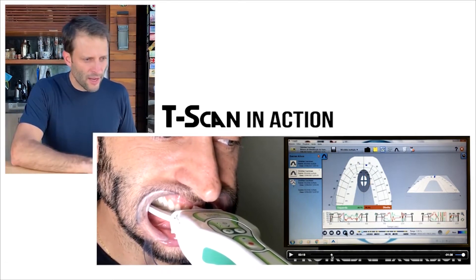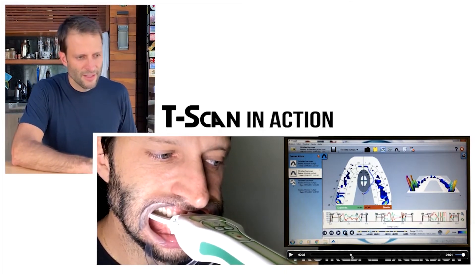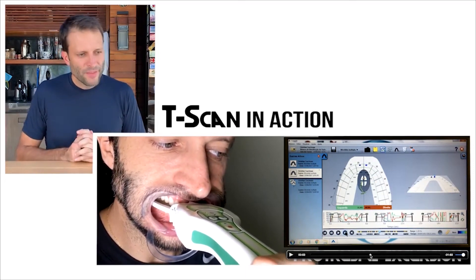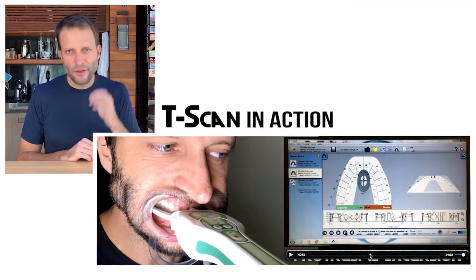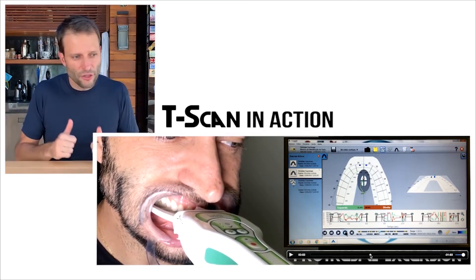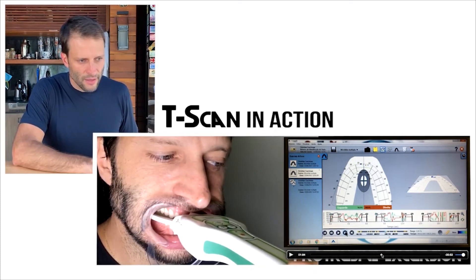As I go edge to edge, I have both centrals touching very nicely. I can slide back, bite all the teeth together again, slide forward again, and see if the pattern will repeat — four teeth, then the two centrals touching together. Imagine we have a restoration or a crown we just did on the central; with T-scan it becomes very clear that as we slide, we did a good job adjusting the palatal side, so the crown and the natural tooth are sliding and touching together on the protrusive movement, all the way to edge-to-edge.